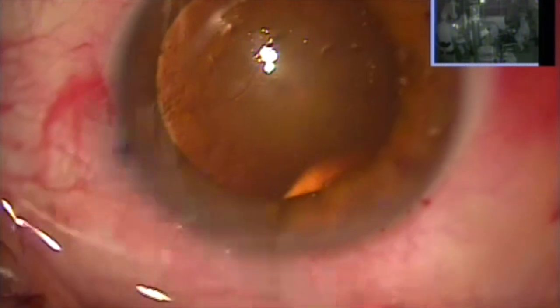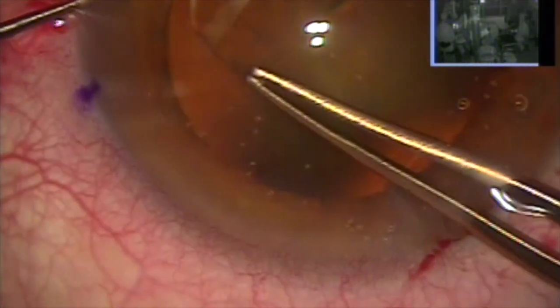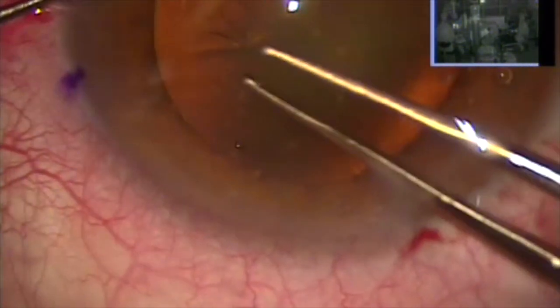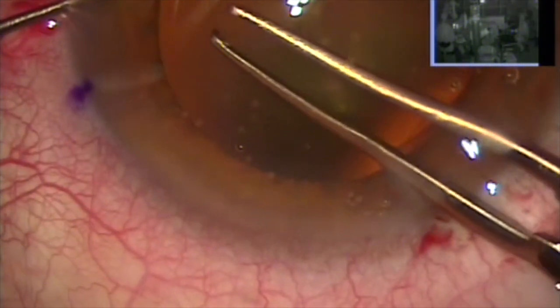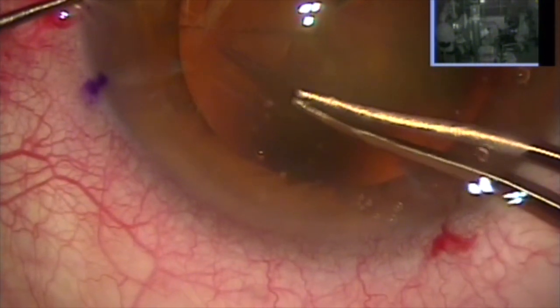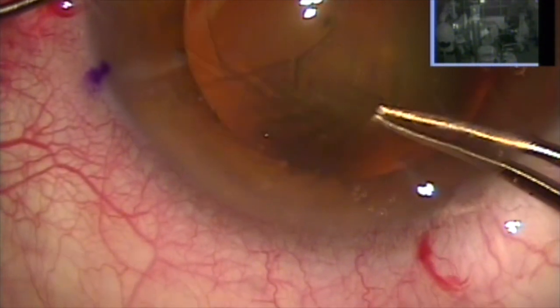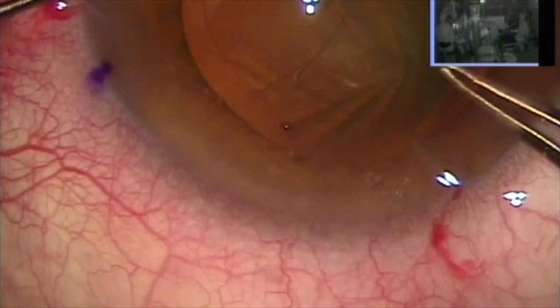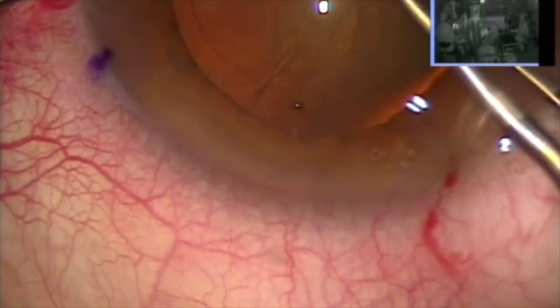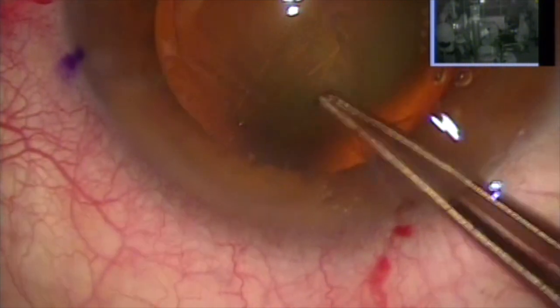Everything here looks relatively straightforward, with cellulose on the surface to get better magnification. But look here at my continuous curvilinear capsulorrhexis — when I tear the capsule, there's wrinkling on the periphery. For those of you who are beginners, the more experienced surgeons who have crashed and burned know that this tells us the zonules are unstable.